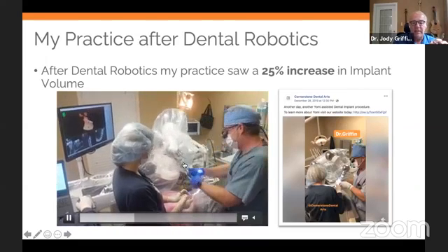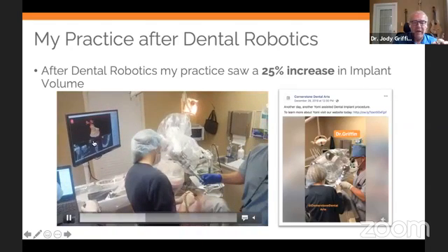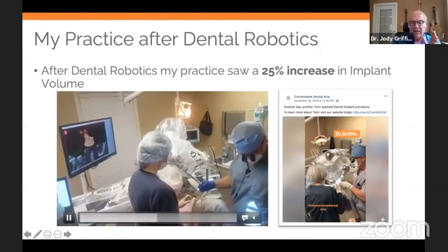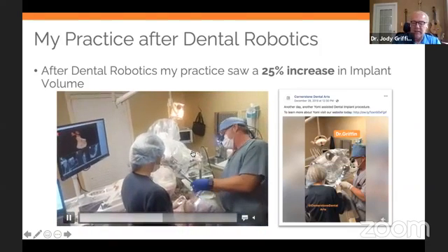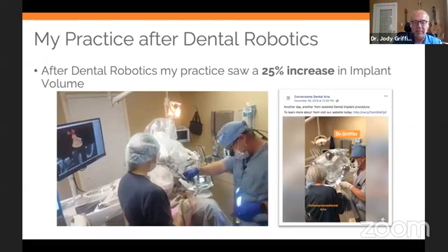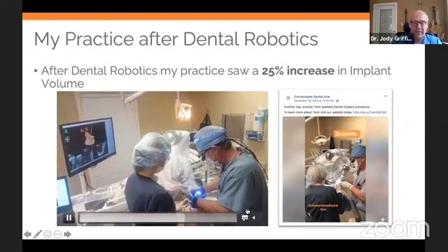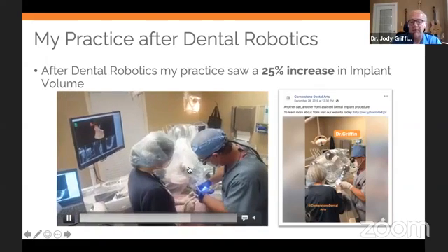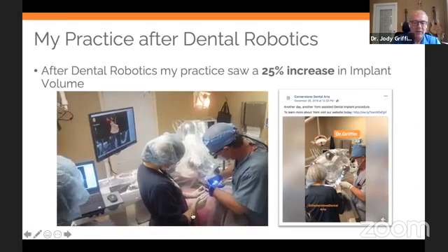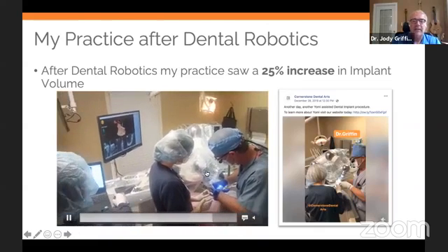The difference is that when you lock into position, you cannot come off of your osteotomy plane. The actual guidance of the handpiece is not adjustable once you start. Once you lock in the program, it stays locked in. There typically is audio on this, but it's not coming through for this particular video. Sorry about that. We checked it before and it was working. I don't know if you can hear it or not.